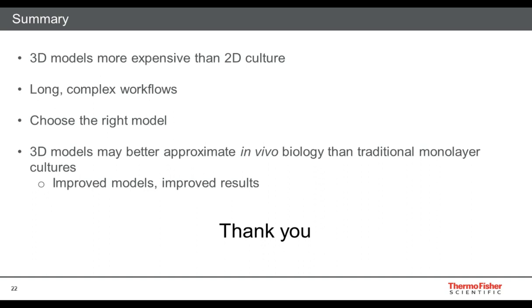And although you can probably control the stiffness of the material, which is a feature that I know some folks are interested in terms of trying to recreate an extracellular environment in vitro that looks more like the ECM environment, in both its biochemical and biophysical properties, in the organ in vivo. So although you can probably do some tuning of stiffness of these materials, being able to modify them with other peptides and also retrieving cells from these materials is not a trivial exercise.